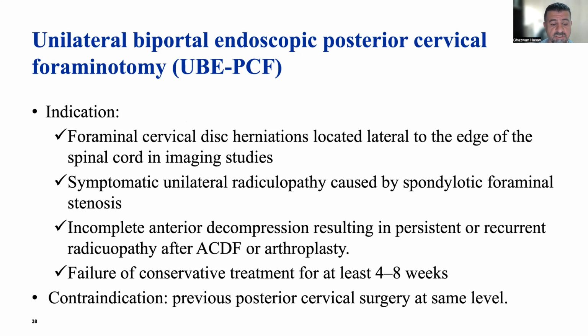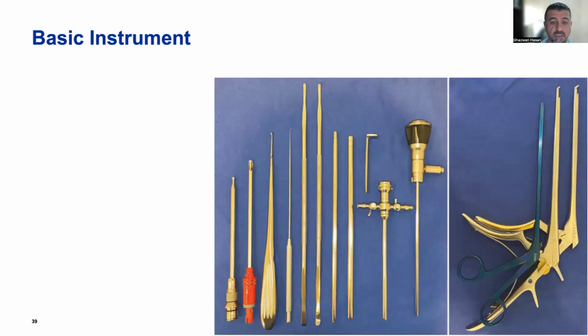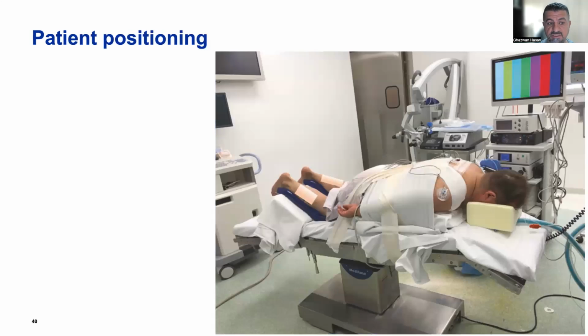And these are the indications and contraindications of this technique. And these are the instruments that are used. You can use the basic instruments for the spine to do this surgery. And this is the patient position.